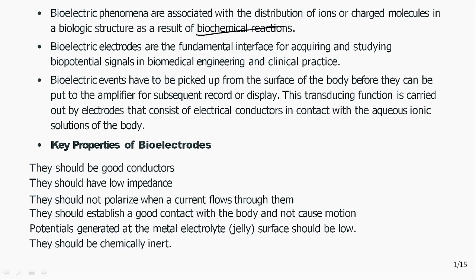Bioelectric events have to be picked up from the surface of the body before they can be put to the amplifier for amplification or further processing. Basically, we can see here the properties of bioelectrodes. They have some interesting properties, and we have to choose accordingly, so that we can capture very sensitively.